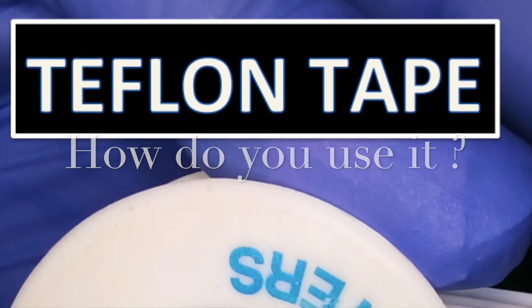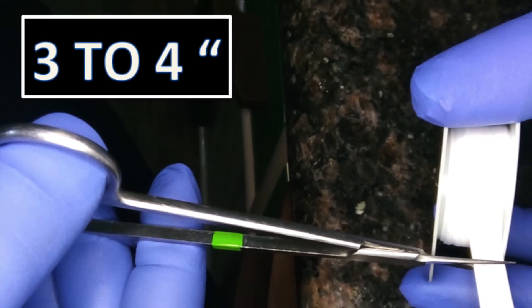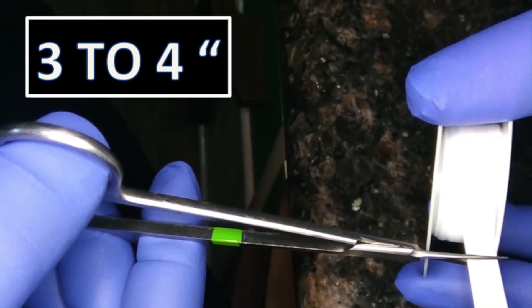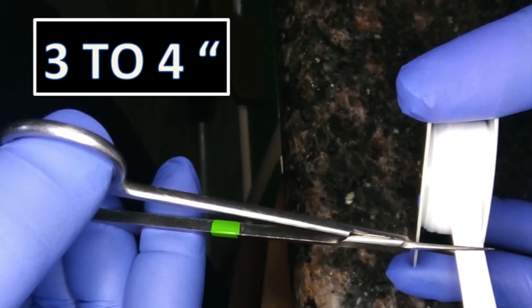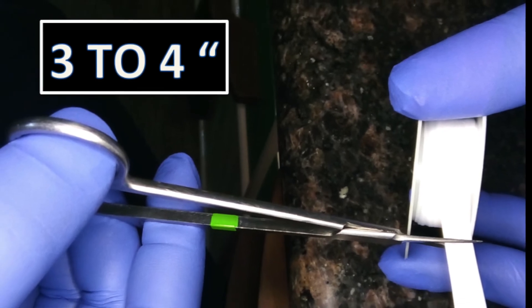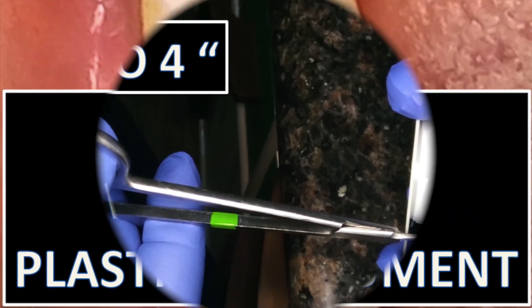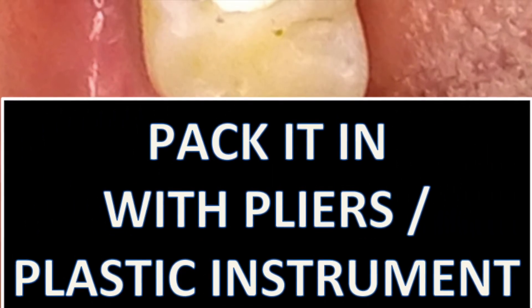How do you use it? Just cut a small length of teflon tape, maybe three to four inches, fold it three or four times, and then manipulate it into the pulp chamber using a pair of cotton pliers or a plastic instrument.